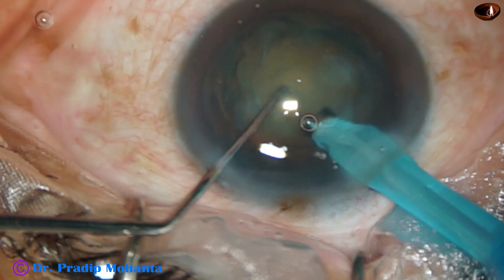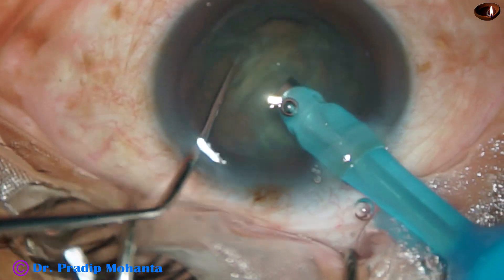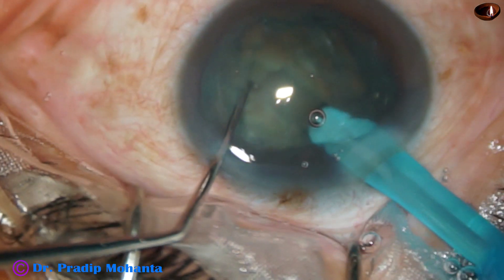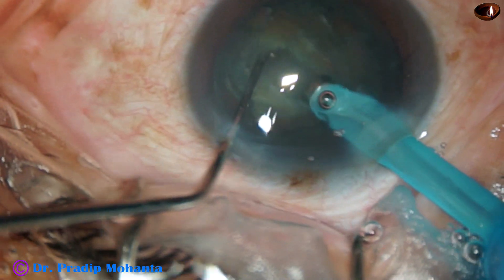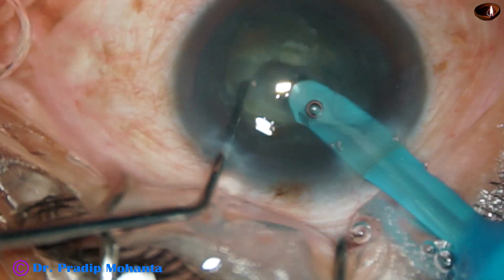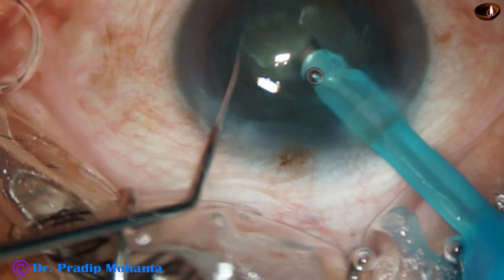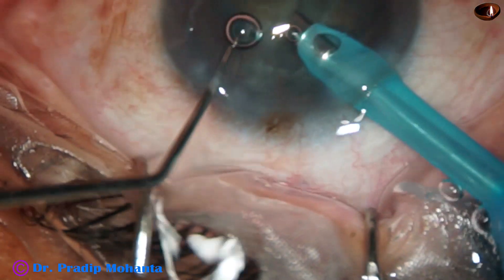Now I try to bury the tip and I find that I am not able to hold the nucleus. So what I did is I used the sculpt mode and made a trench. The central part of the trench is quite deep — you can see the red glow. But as I try to divide the nucleus, it didn't happen, probably because the trench was only in the central part and not from one rhexis margin to another rhexis margin.